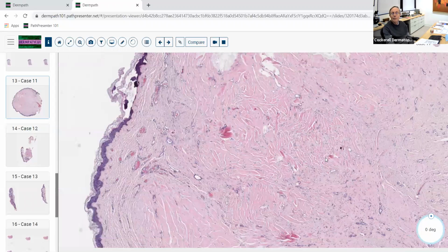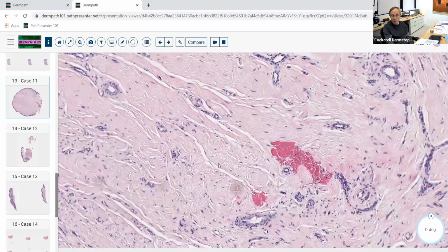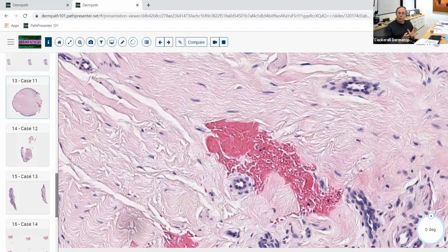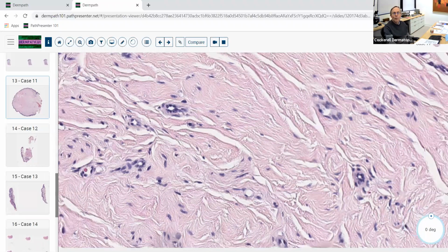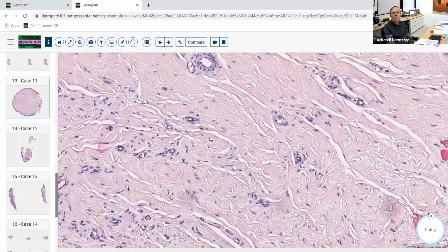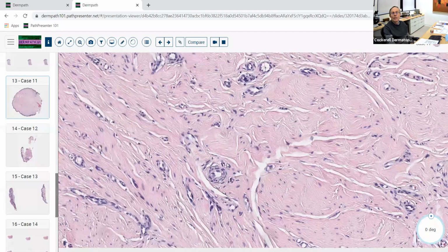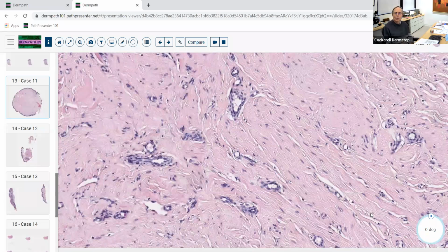And the fibroblasts produce these bizarre, irregular, thick collagen bundles. When it starts off, the collagen bundles don't have that keloid morphology. If it's just a hypertrophic scar, it kind of looks like this. And then over the course of time, they get more thickened and ropey and then begin to look like these kind of pink, thick bundles that we see up in here. So when we see just this material, we can probably call that a hypertrophic scar.